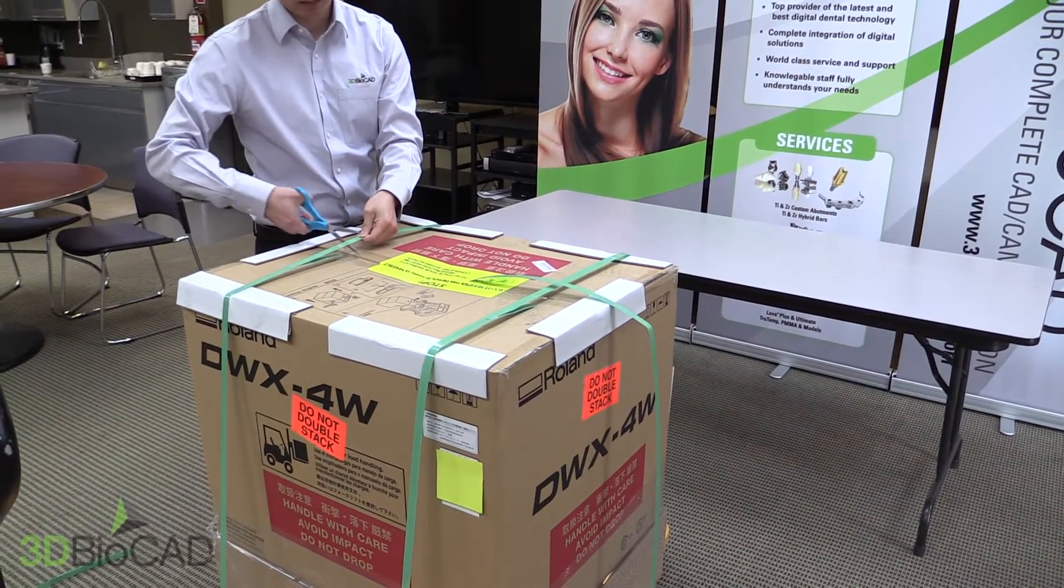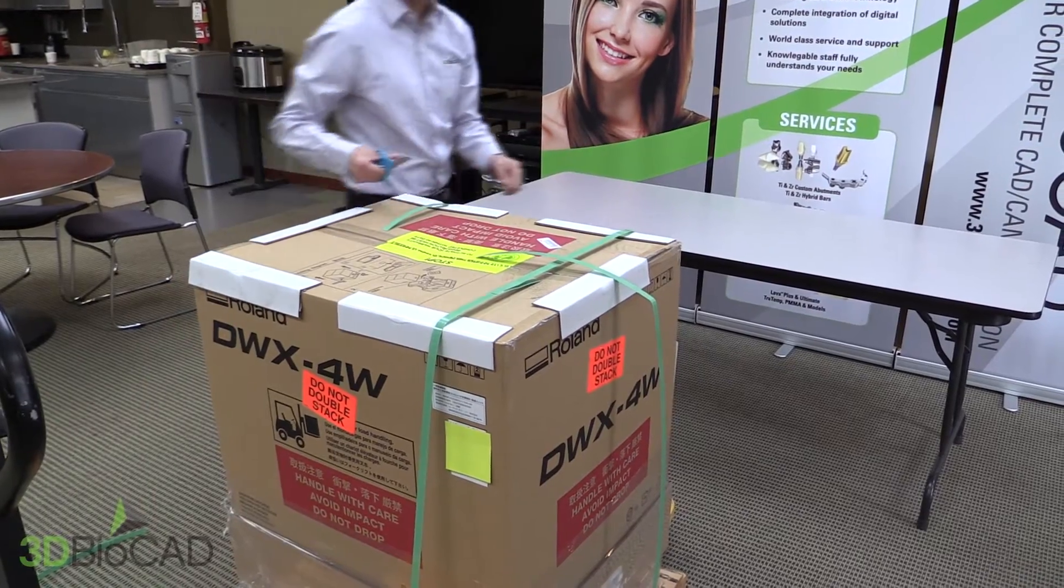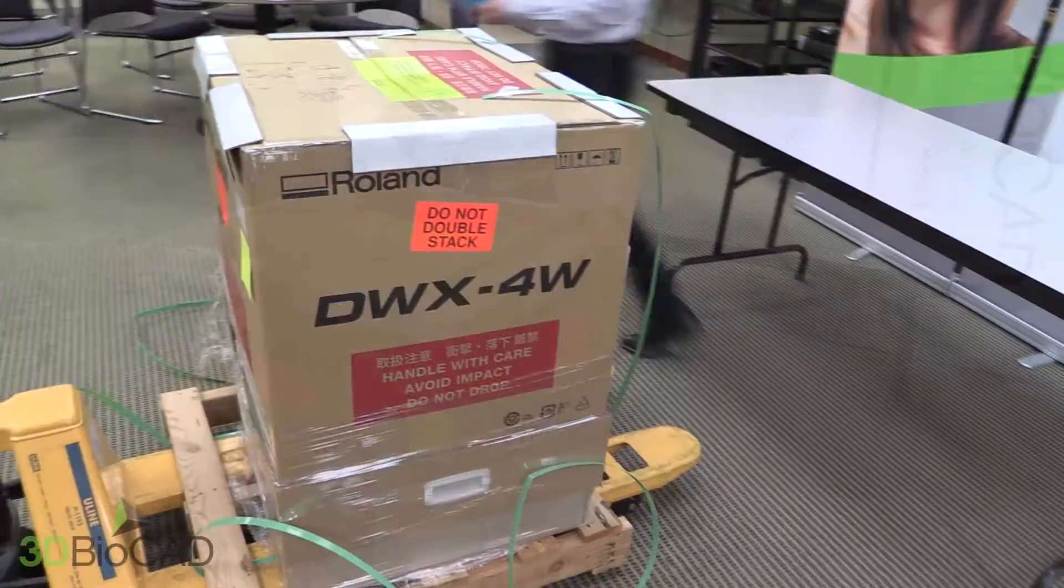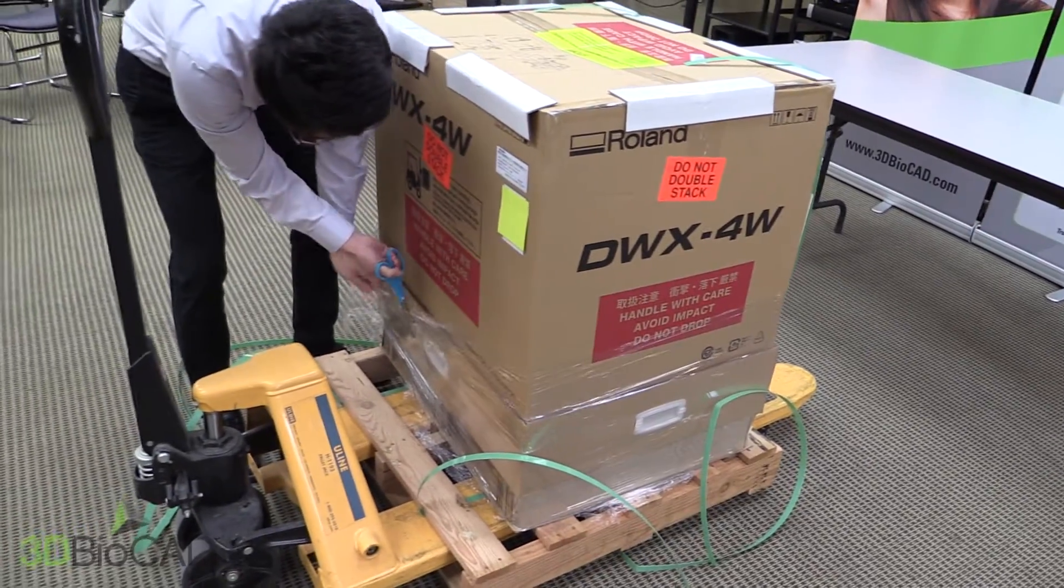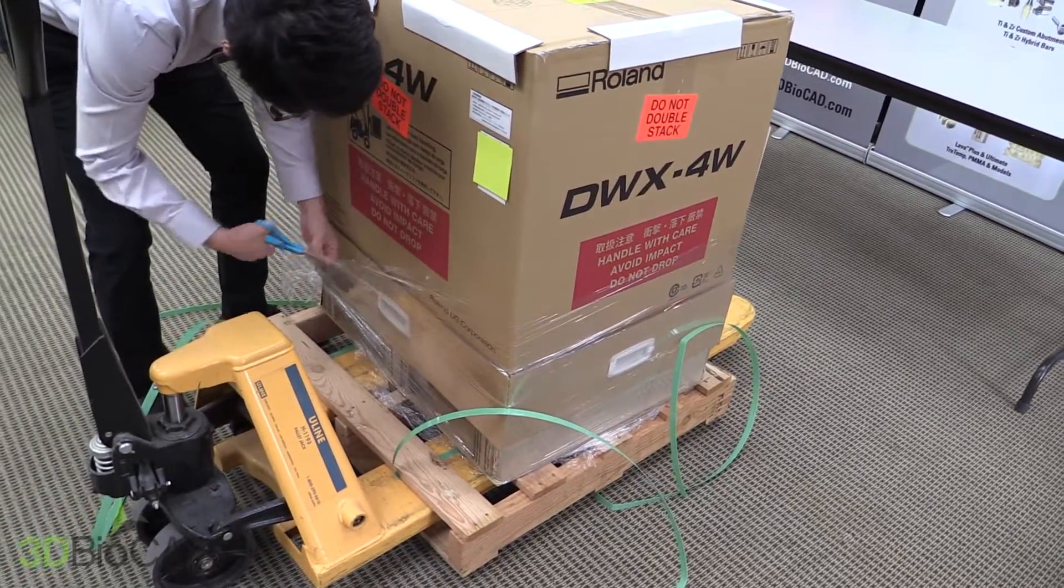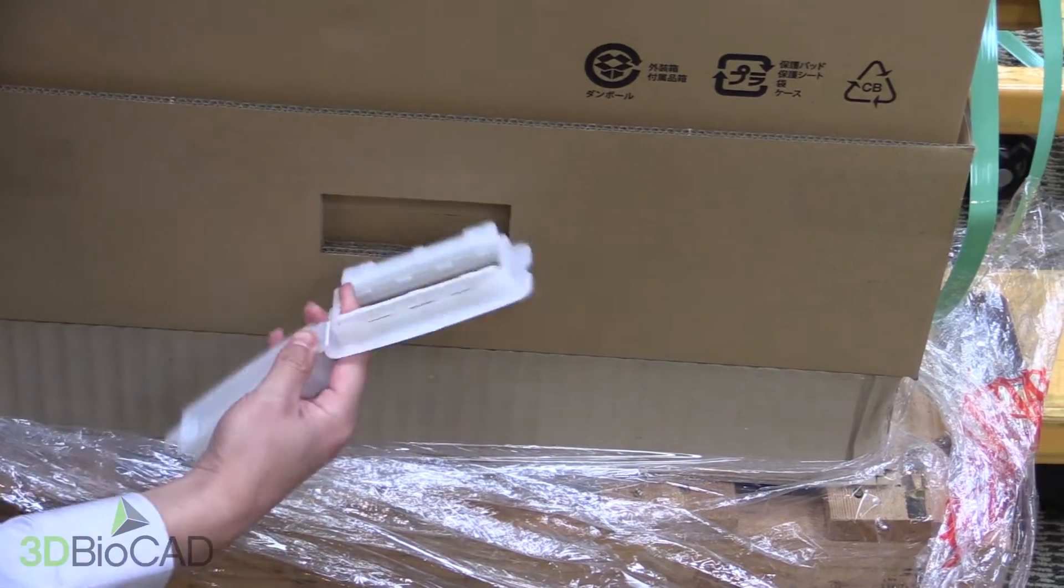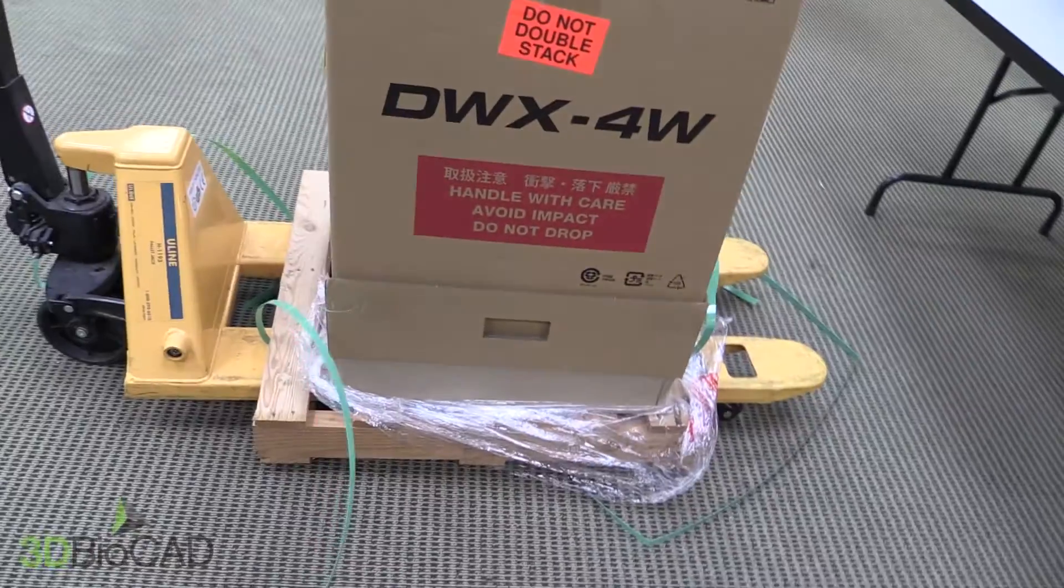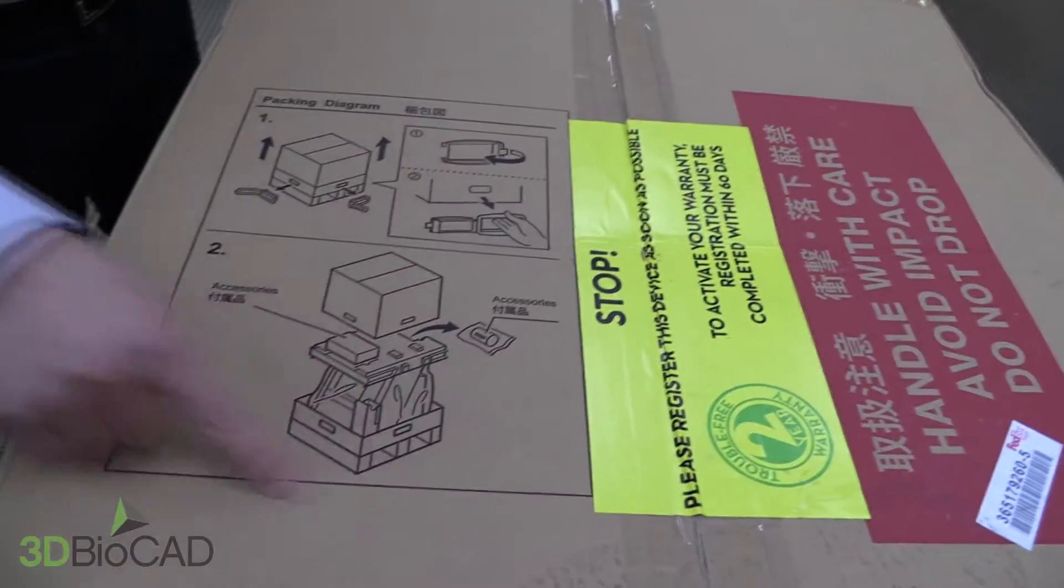When you receive your unit, you need to open the protective box by first cutting the plastic strap and plastic wrap securing the box to the pallet. Once this is done, you need to remove the plastic handles on all four sides by pulling on the right tab, removing the entire plastic handle as shown in the instructions on top of the box.